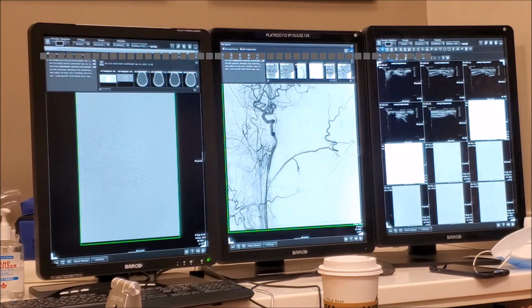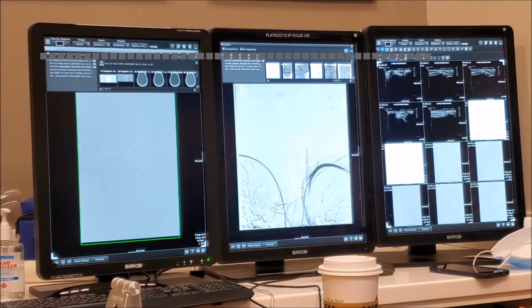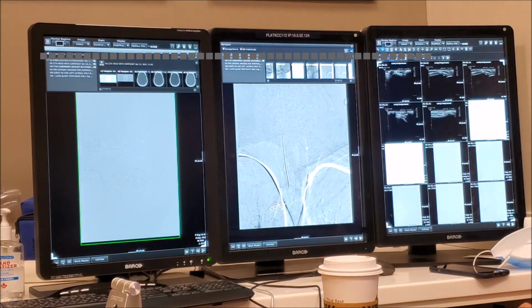See, I have not resolved the meningeal supply to the dura. There's no vertebral on the left? Or direct origin? We thought that there is, but just lower. Yeah, there.